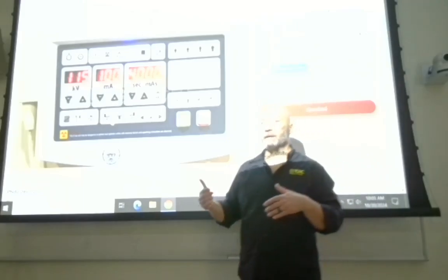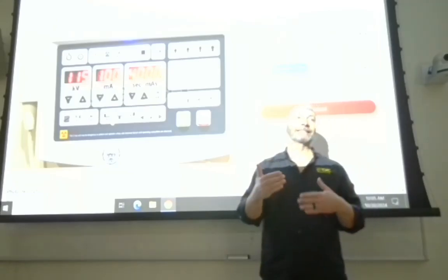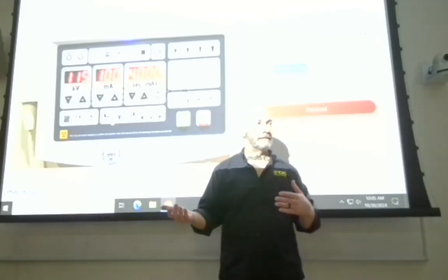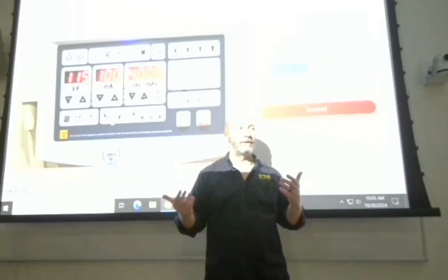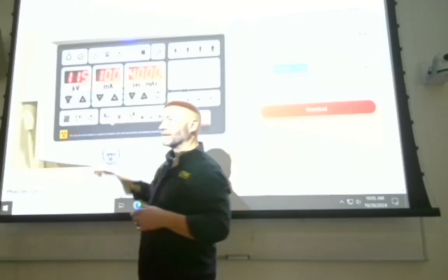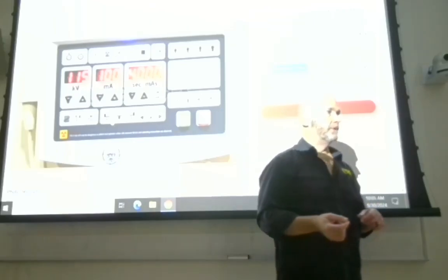The problem there then is that on that pediatric patient, you may need 6 mAs, pretty low mAs. But on a hypersthenic patient, you may need 80. You may need 100, you may need 150. And how do you land on that? It's tough, right? So to take some of that guesswork out, they've created this, and this is what we refer to as automatic exposure control.